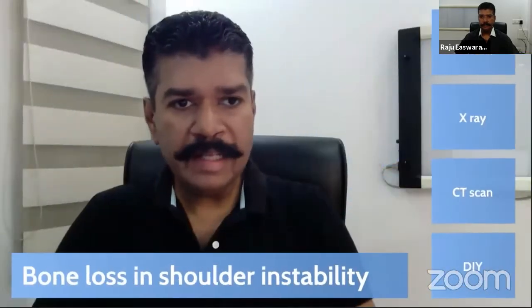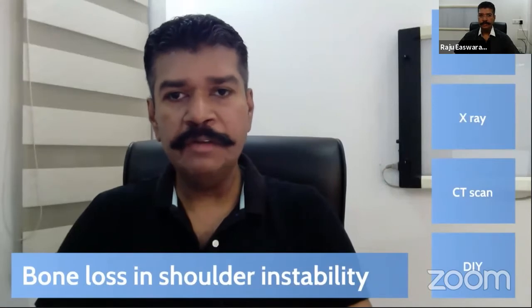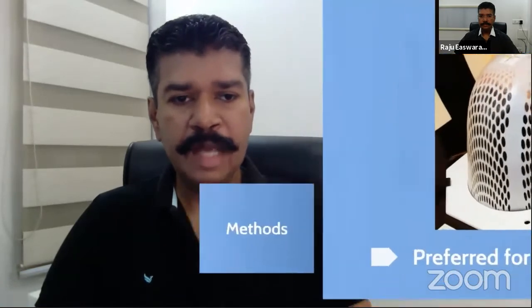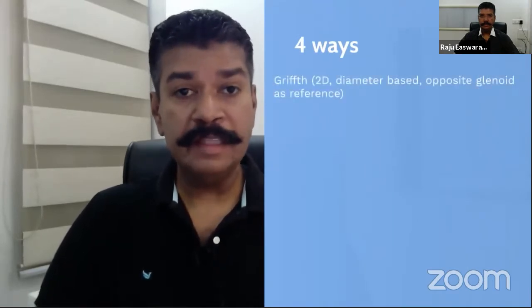So an X-ray puts you on the track. It makes you suspicious that, yes, my patient may have a bone loss, which I need to further analyze. And the best way to do that is through a CT scan. CT is the preferred modality for bone loss. And there are essentially four ways by which bone loss can be quantified on a CT scan, eponymously known as the Griffith method.